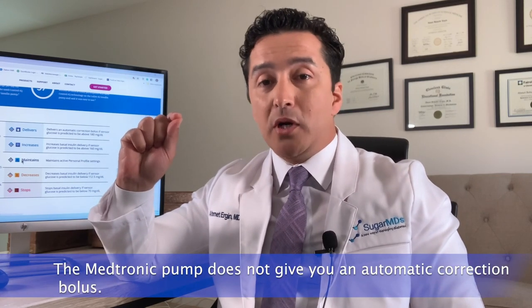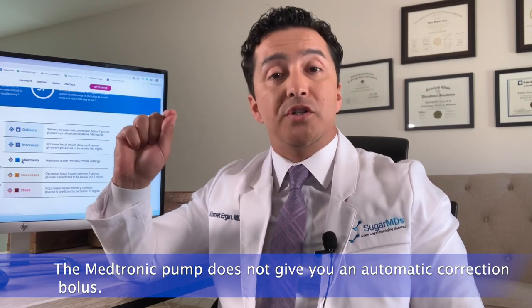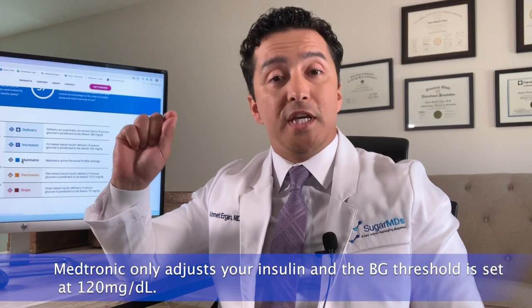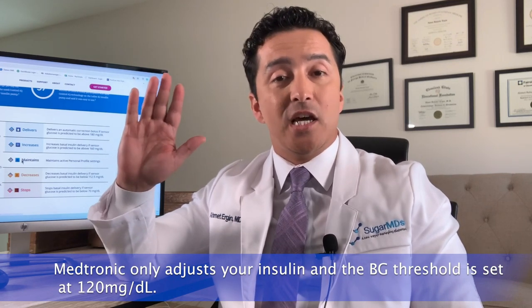The Medtronic pump does not give you an automatic correction bolus. It only adjusts basal insulin, and the target threshold is set at 120 mg/dL. This can be modifiable, which we will discuss later. However, patients cannot manually correct when their blood sugars are high while in auto mode.